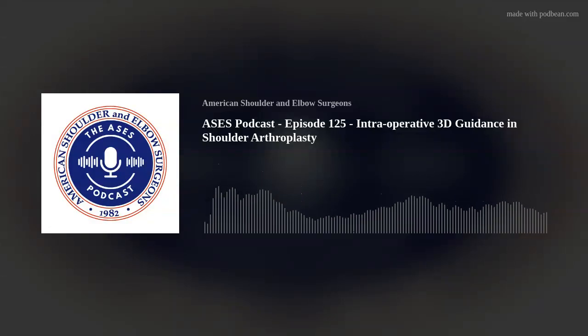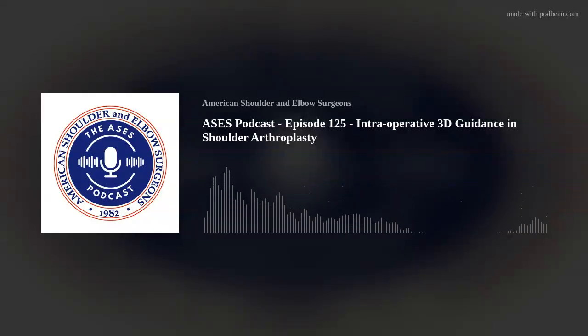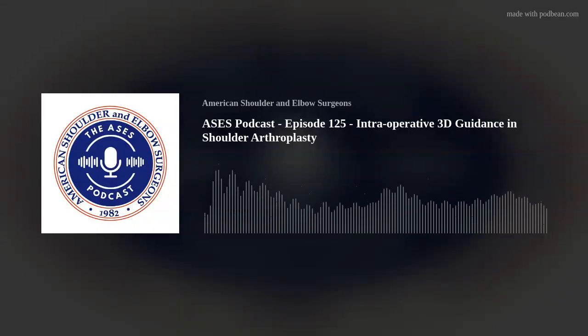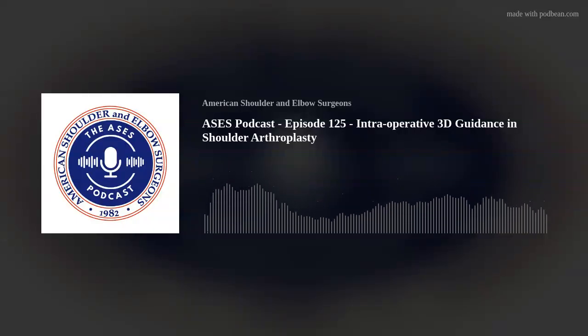I just want to add to that comment about the cost. When PSI came out, I honestly felt that this is not going to last, because navigation will come and take it over, and so will robotics. But if you think about PSI in the most simplistic form, it's something that can be used anywhere in the world. So you could use it in parts of India, for example, if you have a 3D printer and you have approval to actually print it, or the South Pacific, where navigation and then robotics coming into these smaller countries or these big countries that don't have as much money is something we need to be mindful of as a global society. So that's something that's really interesting to discuss.